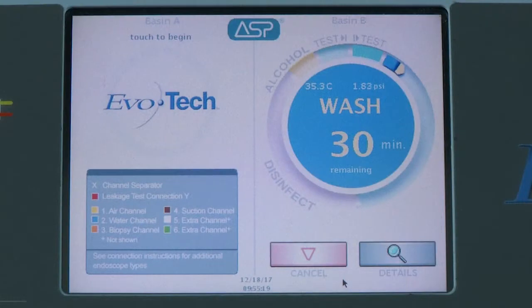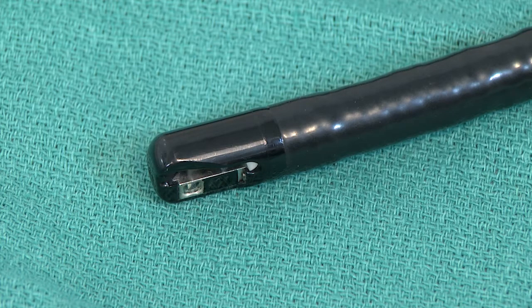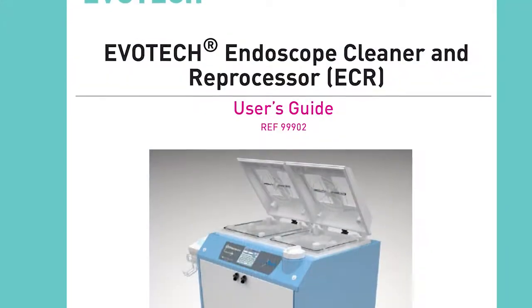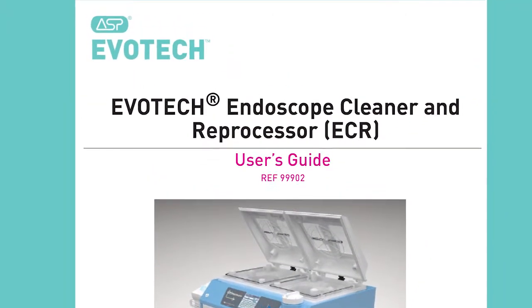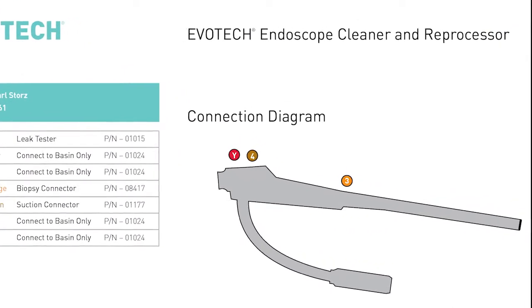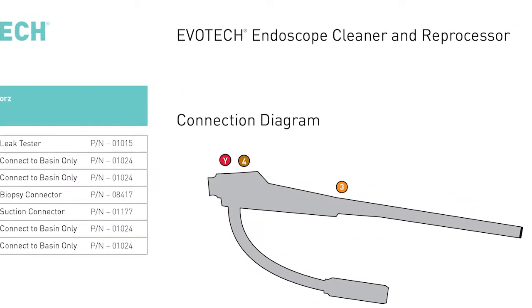Not all endoscopes can be automatically cleaned, but may be high-level disinfected. It is recommended that endoscopes with open-closed elevator wire channels be manually cleaned as per manufacturer's instructions, in addition to using the cleaning cycle of the EVOTECH system. Please refer to the EVOTECH ECR user guide and specific connection diagrams for more detailed information regarding cycle capabilities.